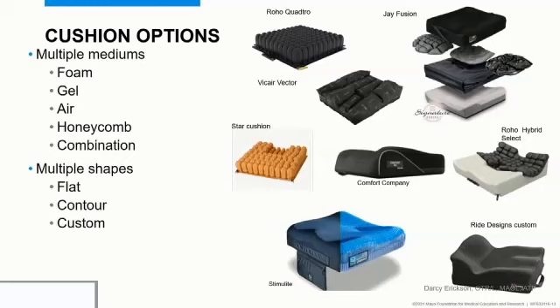And for gel, there's immersion and envelopment. That's what it's there to do. And the cooling properties of some of the newer ones are great to try to keep that heat retention down. And you can get different gel viscosities. So there's some that are more fluid and some that are quite a bit stiffer, and so you can kind of match those needs to persons with how much weight they have, how much they move, how much they're kind of moving their butt around as far as shear reduction. So again, a lot of benefits.